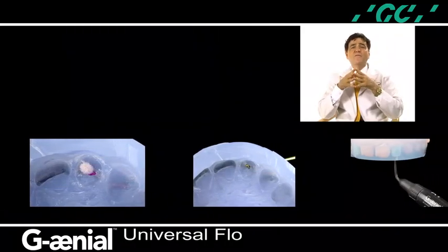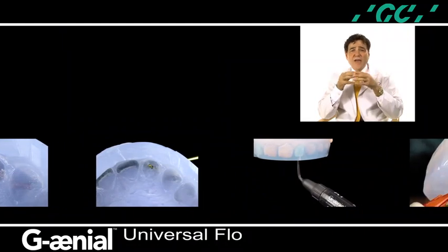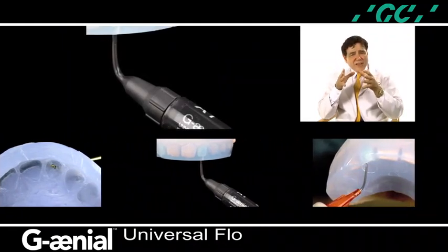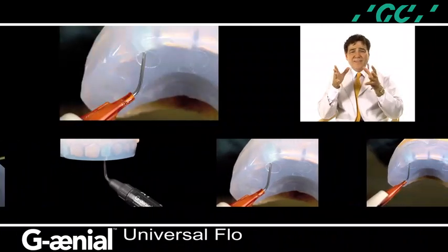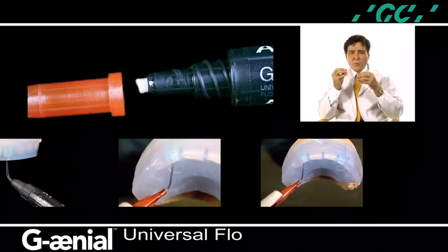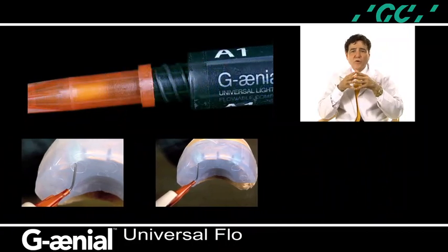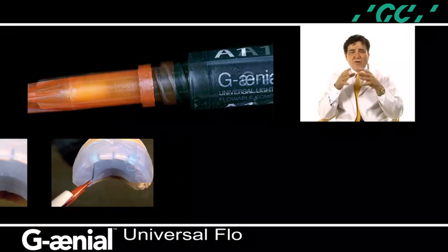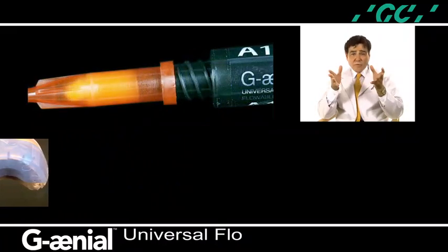I use 2 different tip sizes to inject the flowable material into the matrix. I use the Genial syringe tip, which has an ergonomic design and facilitates placement of the material. And I use the AccuDose needle tube by Centrix. When using the AccuDose needle tube, inject the flowable material into the tube immediately prior to the restorative procedure. The PhotoBlock orange tinted tubes prevent light activation of the material and extend the life of the light activated materials.